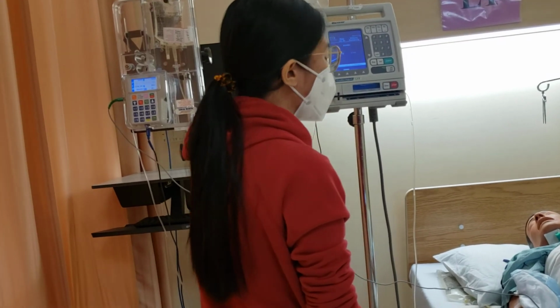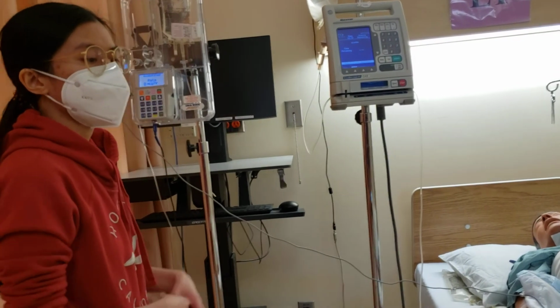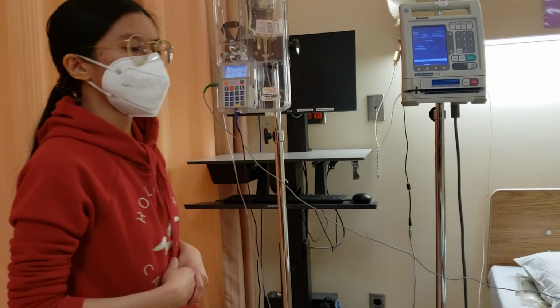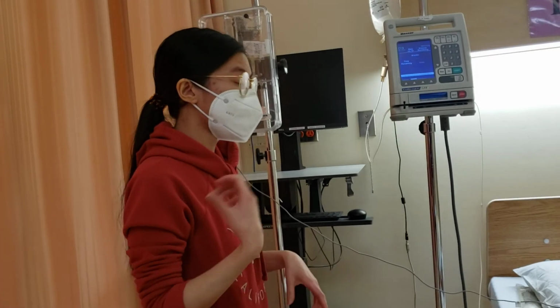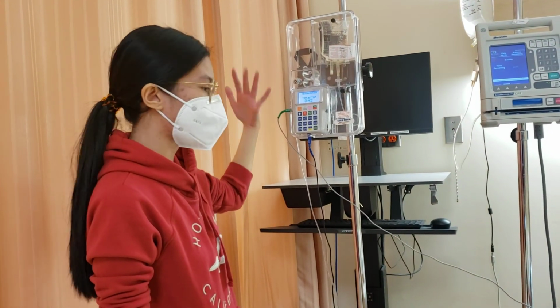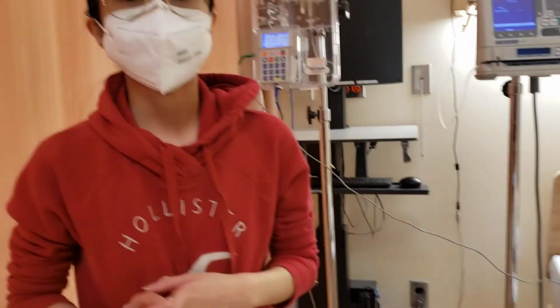And if you have any other concerns, patient said no, and after that we could mark it down that we've changed the bag of the PCA. And we do a quick safety check, exit check, and everything is good. Once again, it's green light, it's beeping, and it's good.